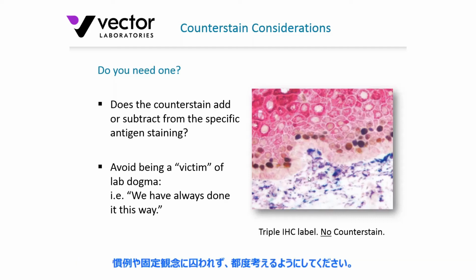So don't be a victim of lab dogma and be told, oh, apply the counterstain for a given period of time because you've always done it that way. You know, that's a bunch of nonsense. And quite frankly, if you want good staining, good results, just ask the question, do I need to use a counterstain?